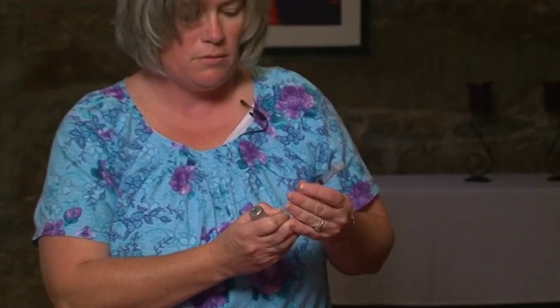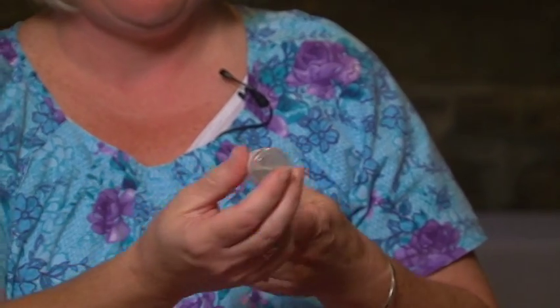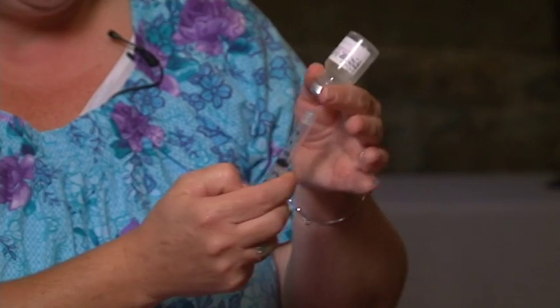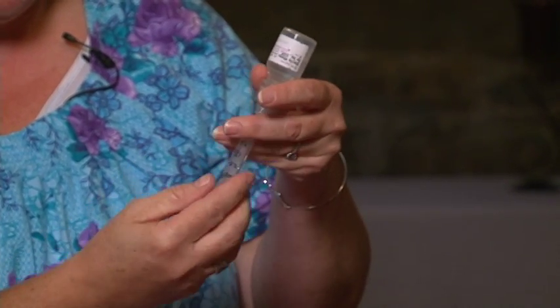Another option for emergency medication is midazolam, and it comes in different forms, but we're going to be training on the intranasal midazolam. It comes with a syringe with a needle. You take off the needle cap, you pull the plunger back to 2 mLs, you puncture the vial with the needle, you put the air in as you normally would, and you pull back.